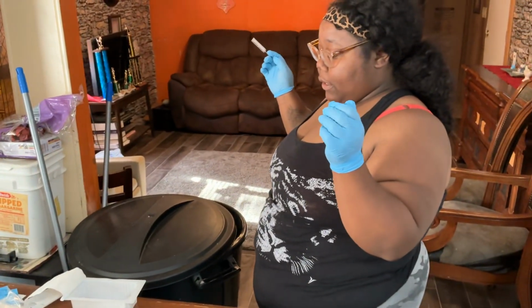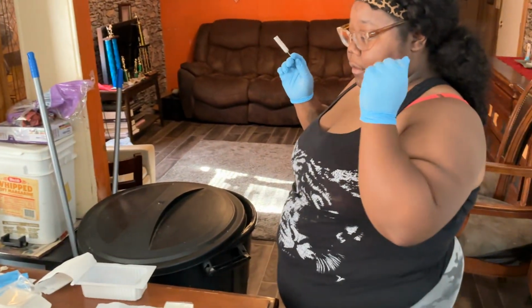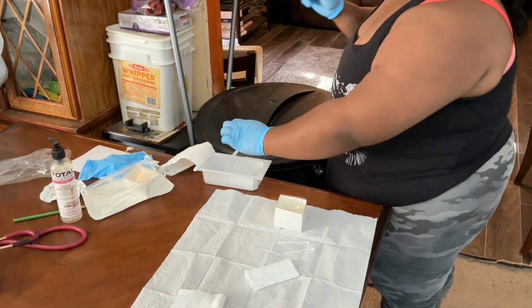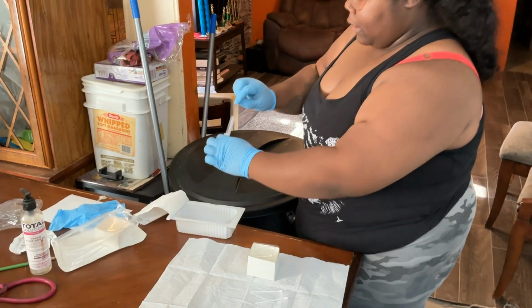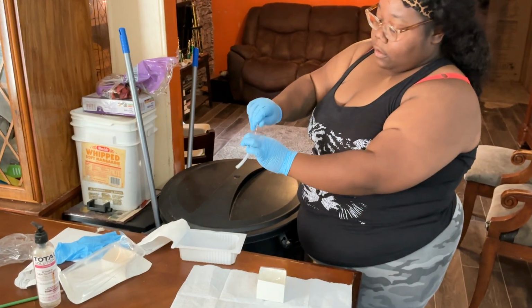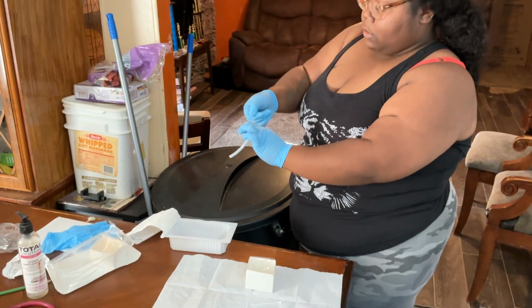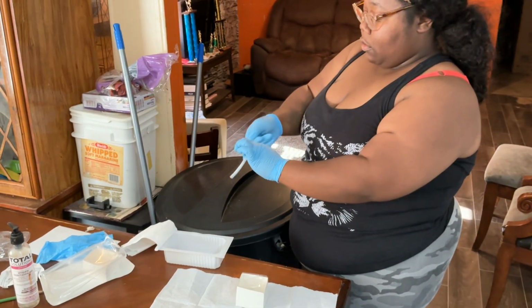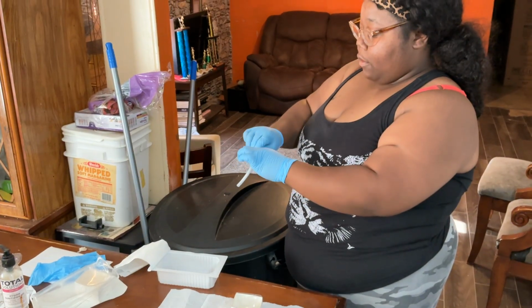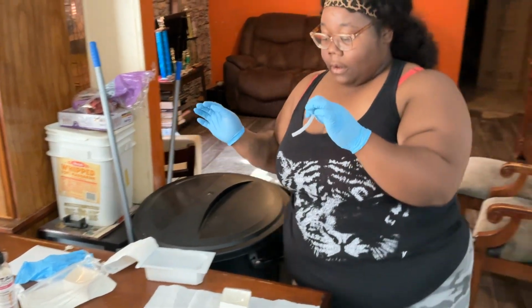What I'm going to do is take it with this hand, pick it up, and I'm going to clean it. I'm coming around my sterile field. Careful not to get over my sterile field. Just going to clean it real good. Get any of that dried secretions that was in there out. I'm going to discard of that in the appropriate bin.